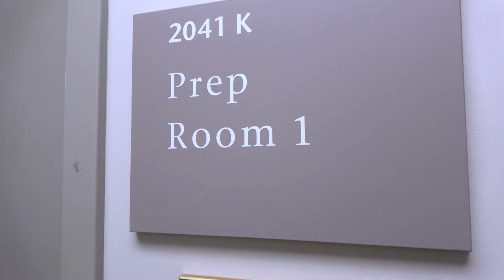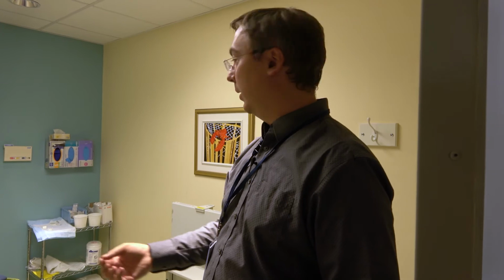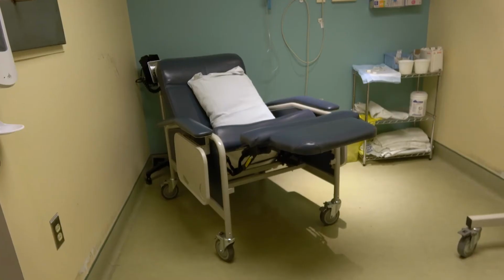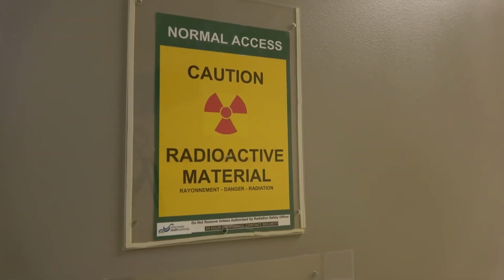So this is one of our uptake rooms. The patient would come in here, they'd get set up with an IV. Our technologists would administer the radioactive sugar, and then we would have them here for about an hour to wait while the sugar gets taken up. So when we give the radioactive sugar, it takes time for the cancer cells to accumulate that, for them to actually eat that sugar so that we can see it. So we want the patient to sort of be relaxed in a quiet environment, eyes closed. They could have a nap if they wanted, and that gives a chance for that sugar to get taken up by the patient and by the cancer cells.